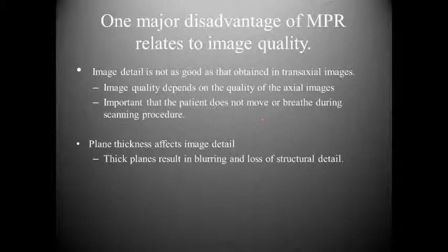I'm sure if you have experienced this on CT, you won't forget it, where you've been doing maybe an abdomen and pelvis, and the machine instructs the patient to take in a big deep breath and hold it, and the patient maybe halfway through the scan breathes. And so initially you don't know whether this motion has created tons of artifacts or not.